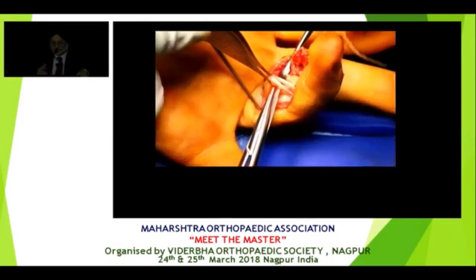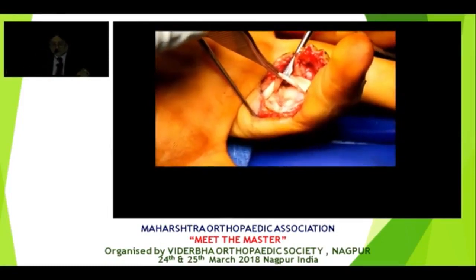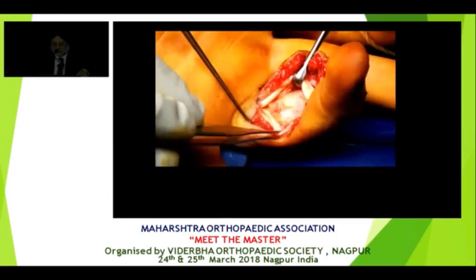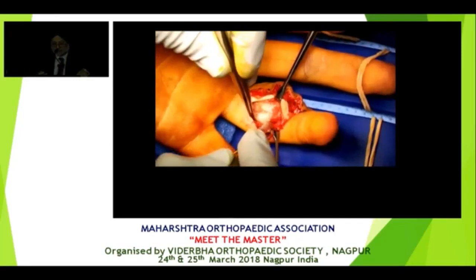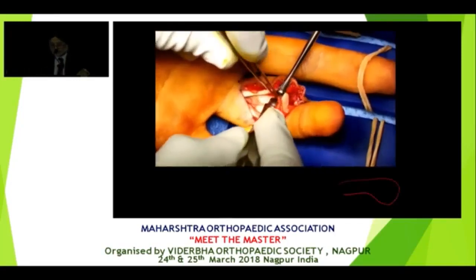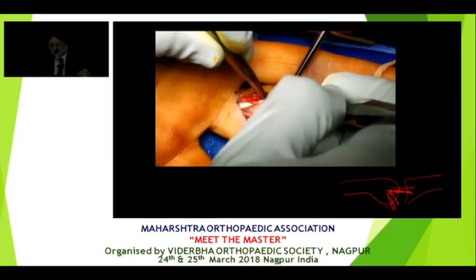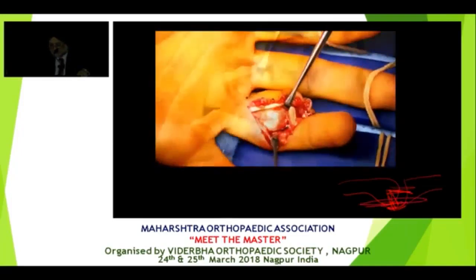I'm going to cut the vincula so I get better access. Okay. So now we're looking at the volar plate over there, right? Now what we're going to do is we're going to cut the collateral ligament on either side, the accessory collateral ligament. So we're going to cut the accessory collateral ligament. So I'm over here. This is the main collateral ligament. This is the accessory collateral ligament on the volar plate. So we're cutting this accessory collateral ligament right here.